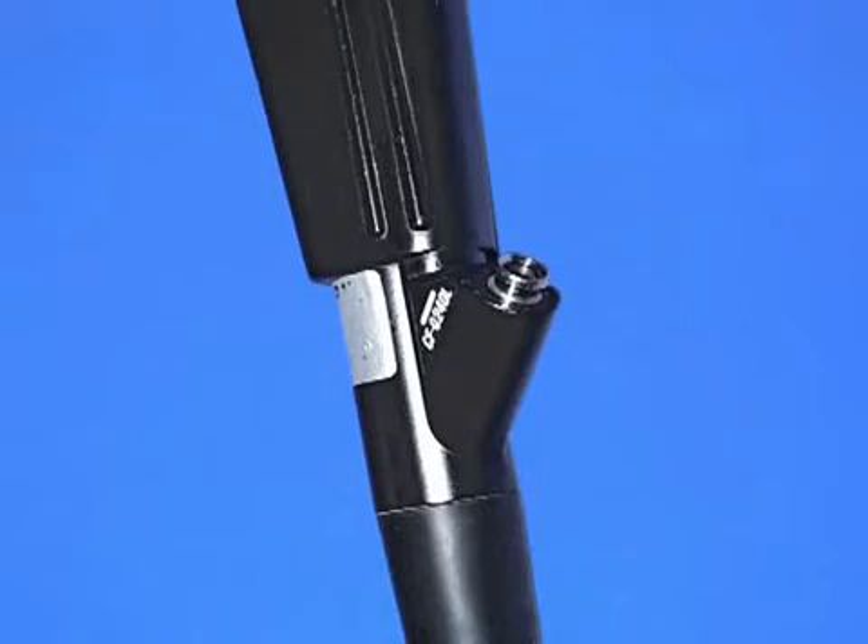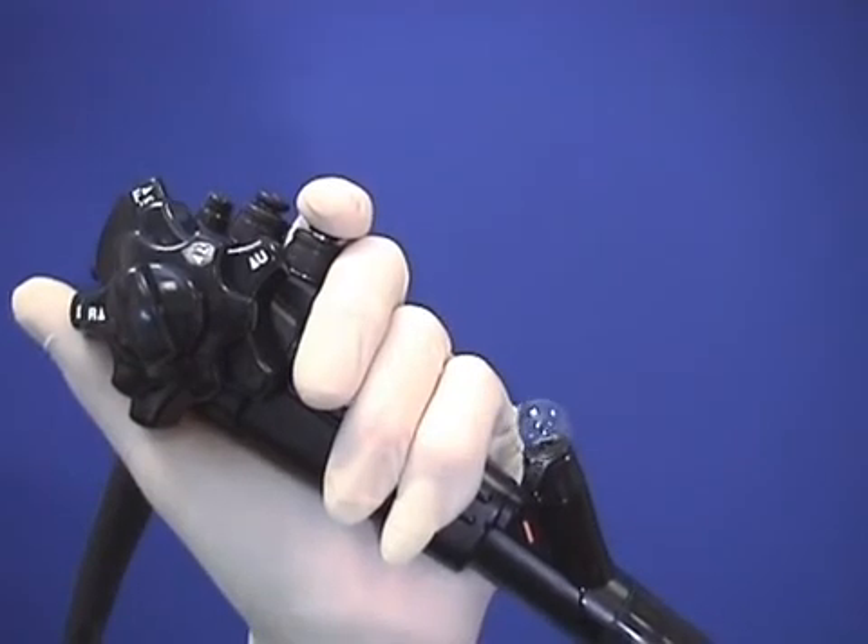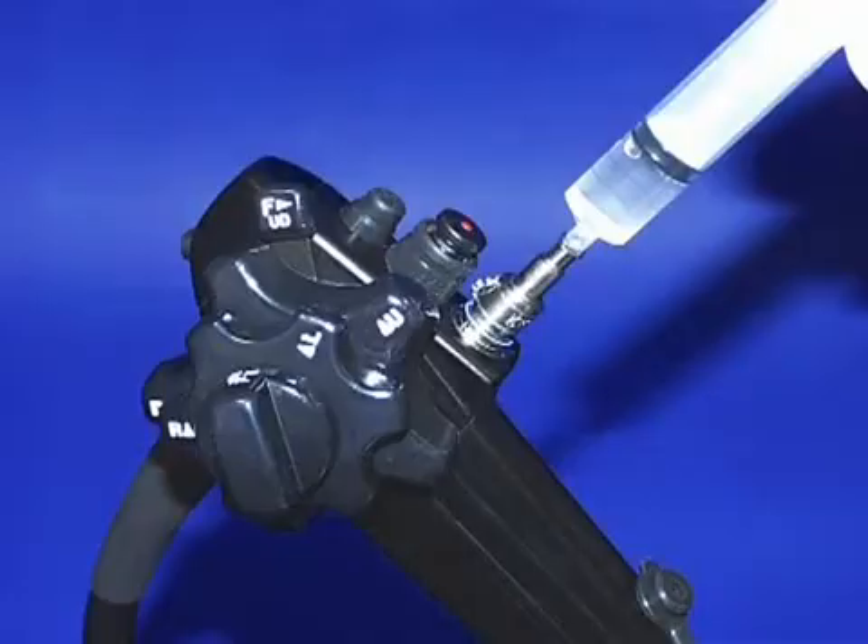Is the biopsy cap missing, which lets the colon deflate, or is it damaged and leaking? If none of these checks finds a fault, there may be a blockage at the scope tip — try forceful syringing with the channel flushing device.